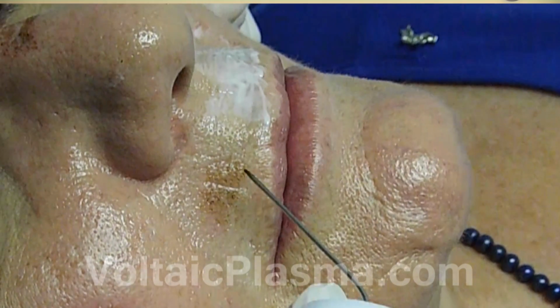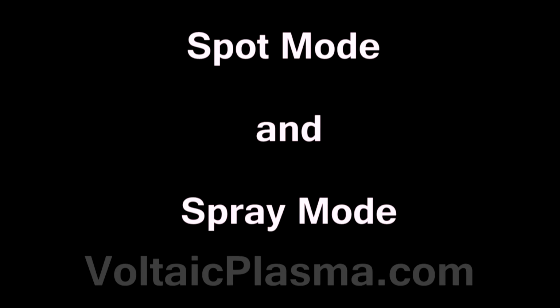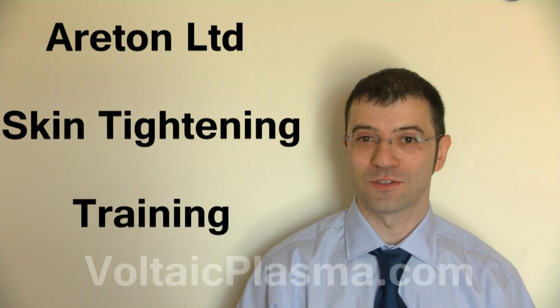With voltaic arc, the techniques used for skin tightening are both spot mode and spray mode. The method we prefer is the spot mode because it is the easiest to learn and accomplishes consistent results. Spray mode operation is also used by experienced users.